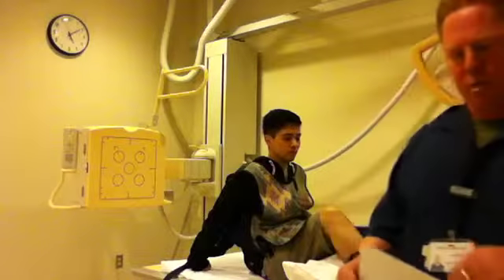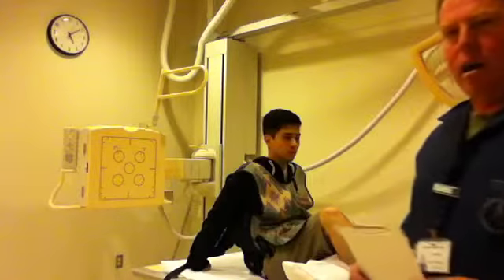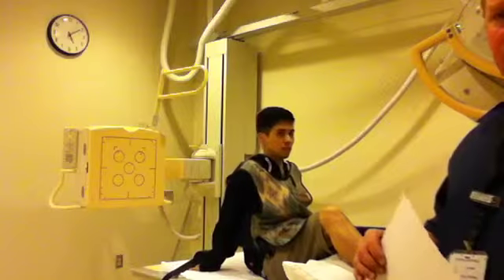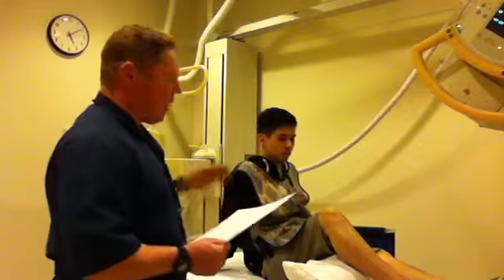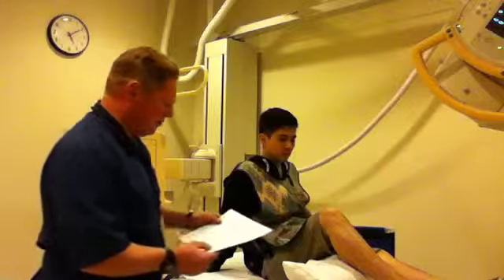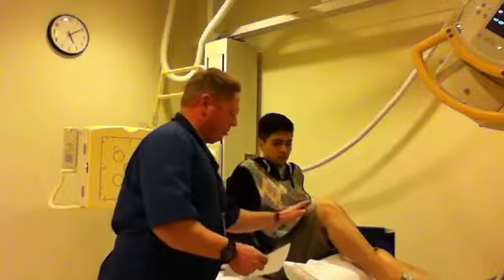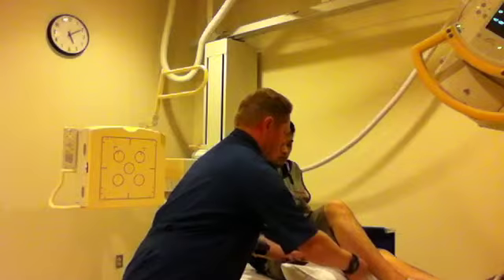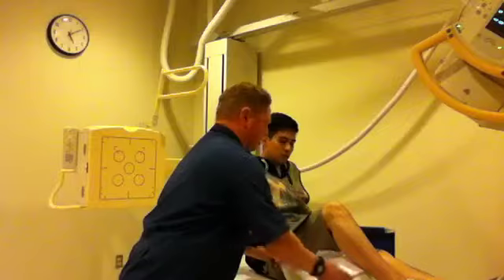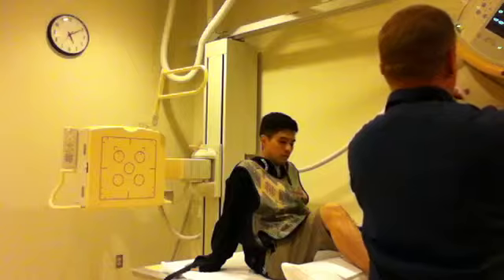Again, I'm gonna be doing 2 exams here, the Leclerc and the Sunrise, or Settegast. So I'm gonna have my plate. I'm gonna have the patient lie on the bed like he is right now. For the Leclerc, I'm gonna have him bend the knee like this. I'm gonna have a pillow underneath. I'm going to put the plate underneath, and then now I'm going to go ahead and get this angle to the right.